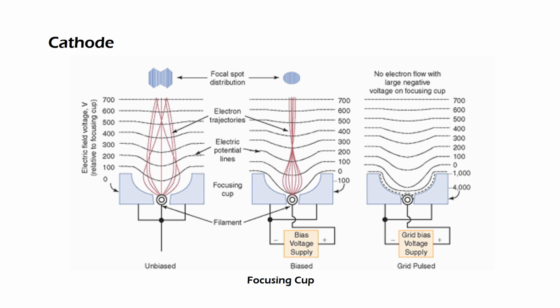As a large voltage is applied between the cathode and anode in the correct polarity, electrons are accelerated into a tight distribution and travel to the anode, striking a small area called the focal spot. The electron distribution, a typical bimodal distribution of the current density, can be seen in a pinhole image of the focus.